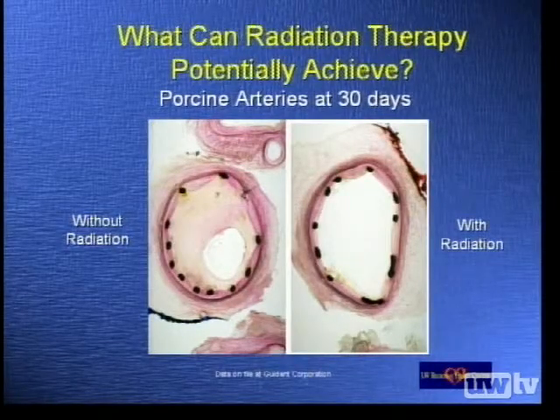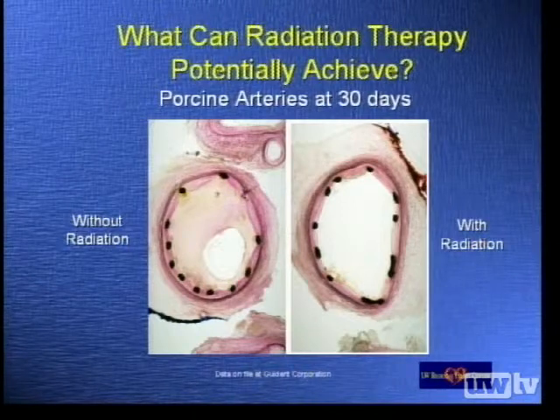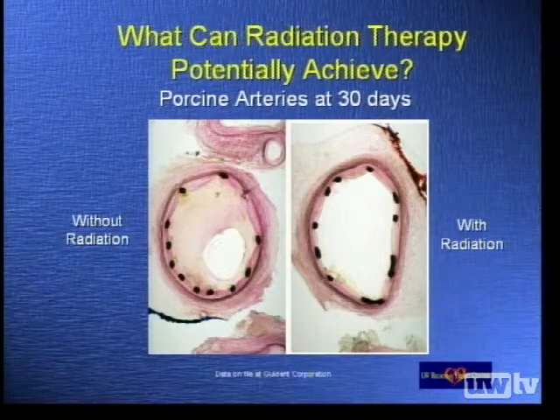I think it's fair to say in the patient that's been presented so far that we have diffuse in-stent restenosis, which places that patient at significant risk for subsequent restenosis. Well, turning our attention to what we can potentially do at this point, commercially available currently is radiation therapy. Now, the idea behind this is, since this is an injury, this is wound healing. If you have over-exuberant wound healing, there's data in the literature from the standpoint of dermatology, for example, with keloids, where radiation therapy does have an impact on subsequent healing. And so the idea here is, can you inhibit healing to the point where you allow healing to occur, but not to the point where you produce restenosis?